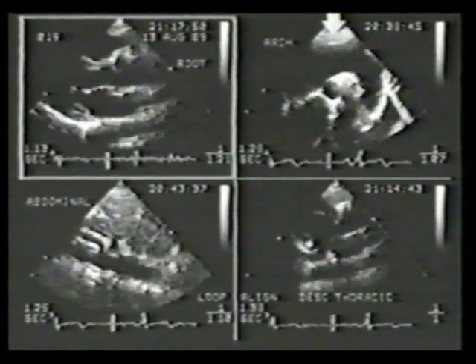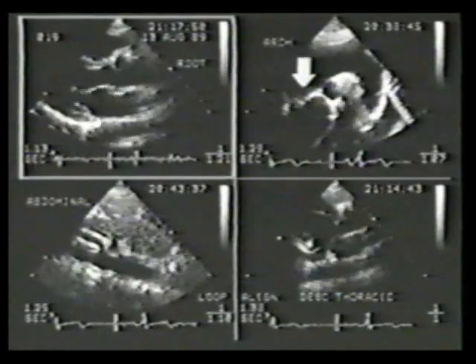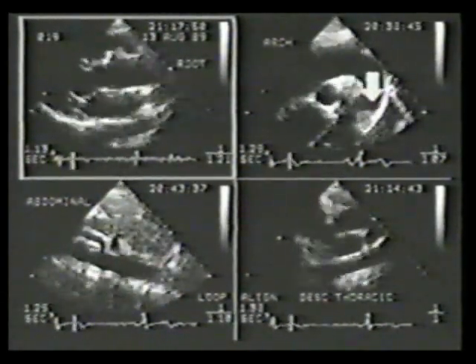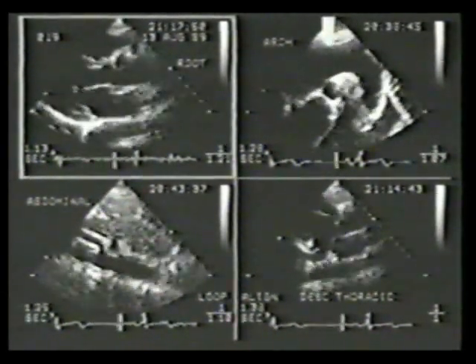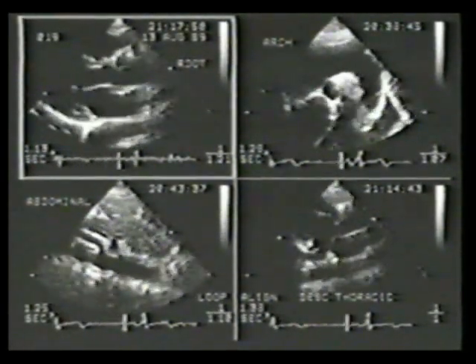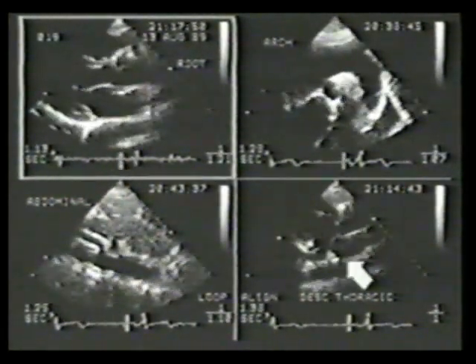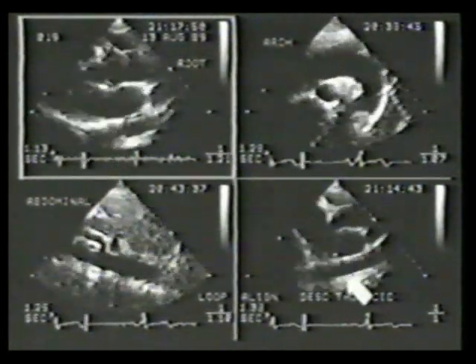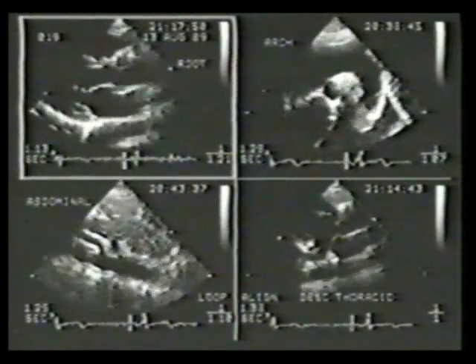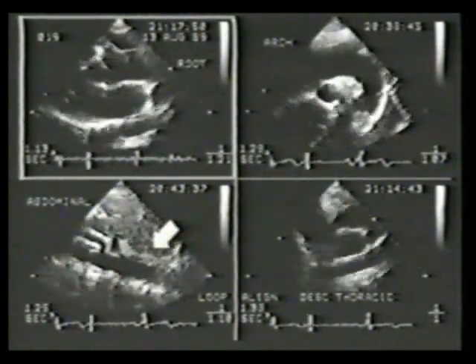of the aorta. The arch is imaged from the suprasternal notch. The ascending and descending aorta can also be investigated from right and left supraclavicular positions. The descending thoracic aorta can be visualized behind the left atrium using a left parasternal approach. The abdominal aorta and its branches can be fully visualized using subcostal transducer positions.